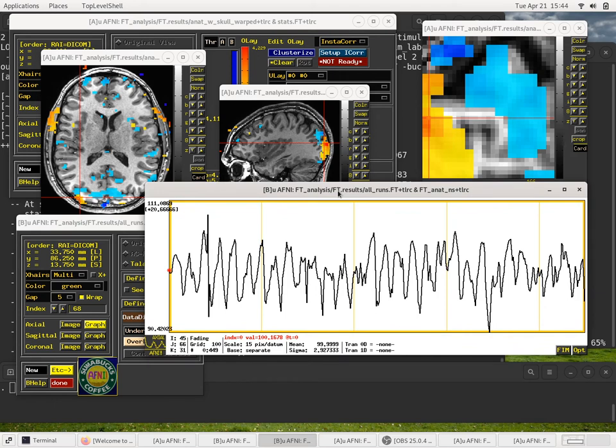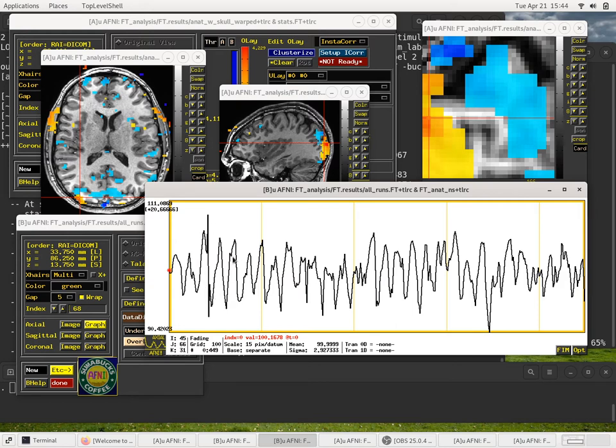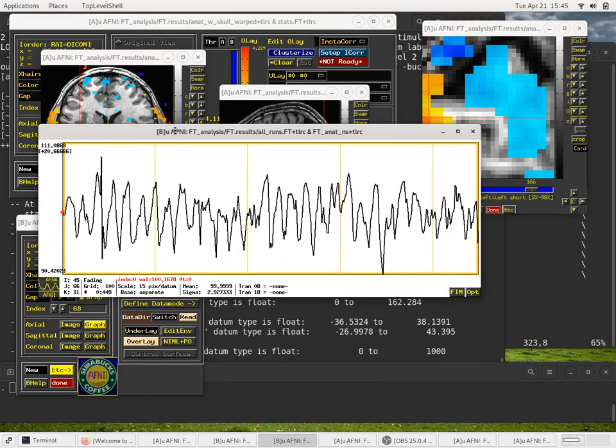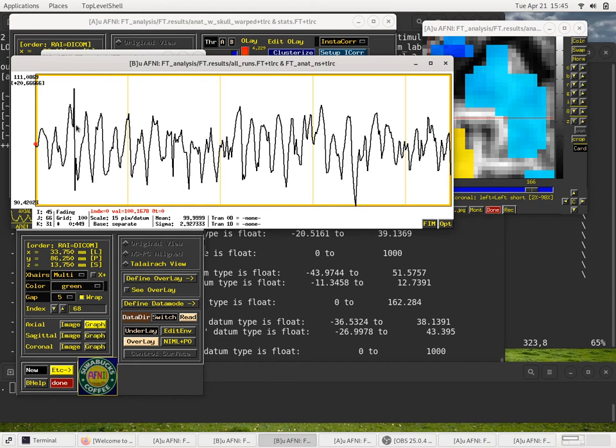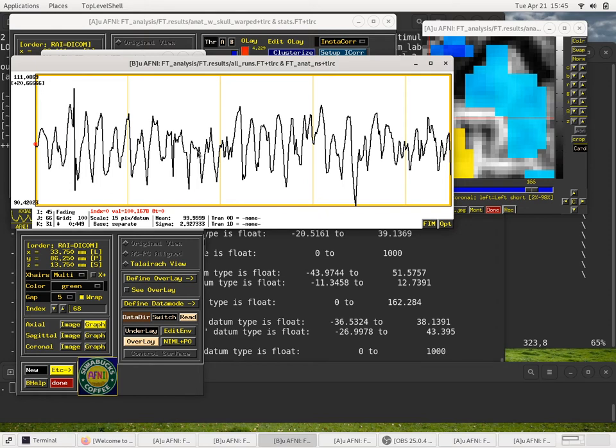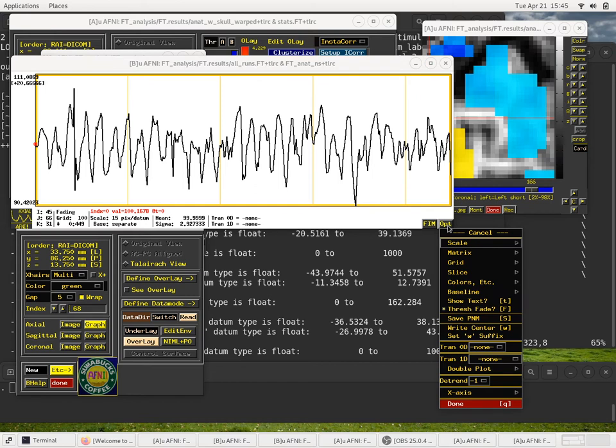Here's the central voxel. How do we get a more clear idea? This looks very clear as it is. But it would be nice to look at the fit time series to see how well the model gets fit to the data. We should be able to see how close the fit looks to the black curve. To do that, you use the double plot method. Note that that's only useful because we can see a clear bold response curve in the data. We've got 20 second events and we're comparing visual and auditory against fixation. So it's very strong. If you have a fast event related design, the best voxel in your data set will look like noise. So there's hardly even any point looking at it. But here we can see something.